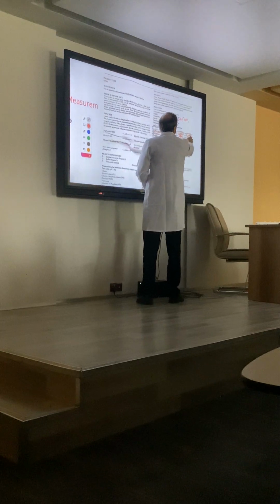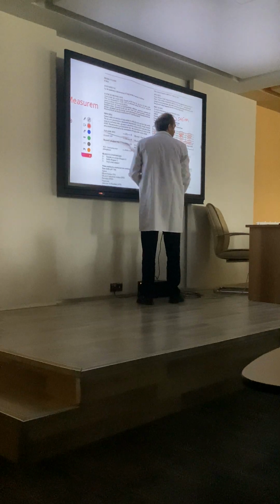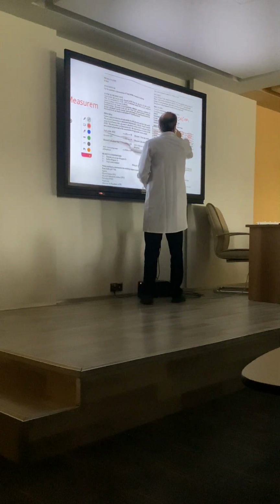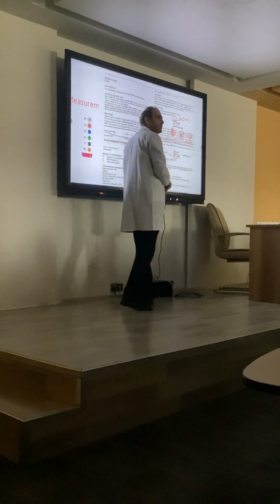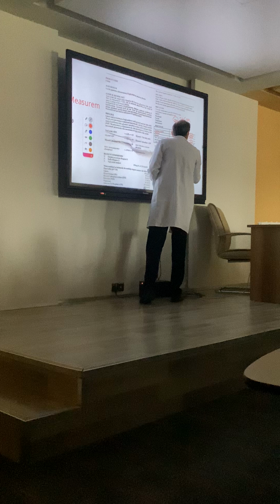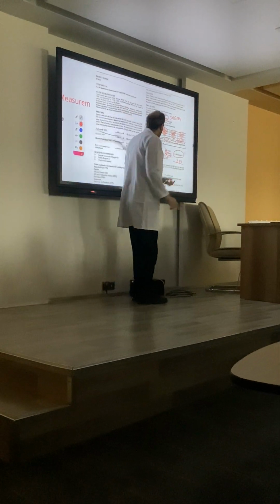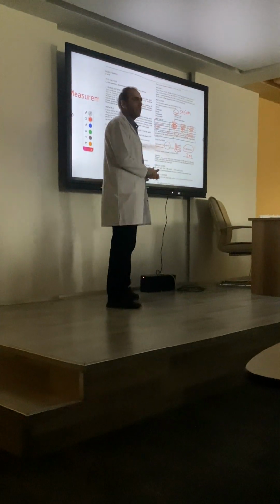You have a sample, a standard and a blank. The OD of sample minus blank is delta A of sample. OD of standard minus blank is delta absorbance of standard. If we set the instrument by blank on 0, you have just the OD of sample and OD of standard, multiplied by the concentration of the standard. How much is it? 200. So the OD should be multiplied by 200, and it will give you the triglyceride concentration in milligram per deciliter.